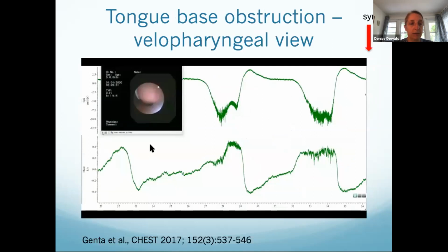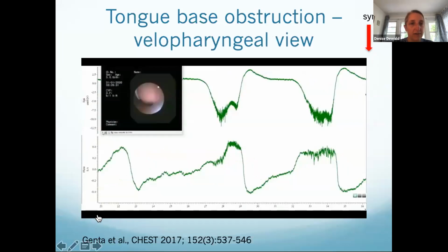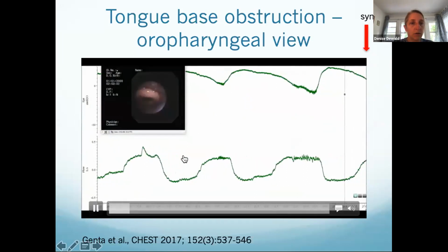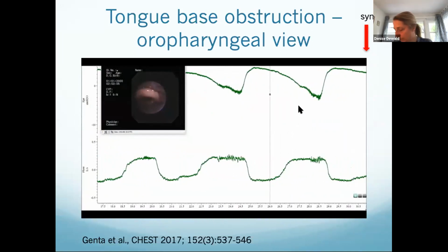So just this plain flattening. And so here was this video here. Upper signal is pressure, bottom is flow. Yeah. Now what happened with this? No, it's not playing. All right, well, this means it'll be really fast. Interesting how it's not playing in Zoom. All right, so we'll just, too bad I took down those other slides, man. All right, so anyway, oh, here it is.